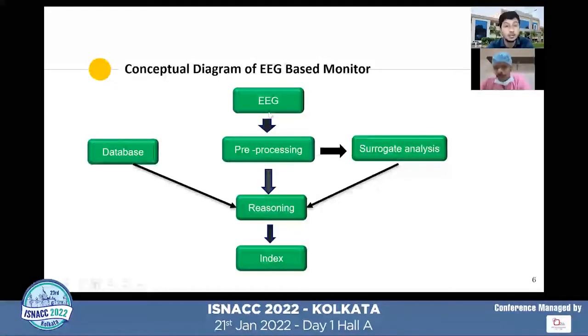Signals are converted to digital signals by the analog to digital converter. Once it is done, the next step is pre-processing. During pre-processing, the machine analyzes which part of the EEG has to be analyzed. After pre-processing, the next step is the application of the algorithm. In the first step, the artifacts are removed from the EEG signal. The main artifacts come from cardiac activity and from EMG, the frontal muscle activity. The reliability of a depth of anesthesia monitor depends upon the quality of artifact rejection.